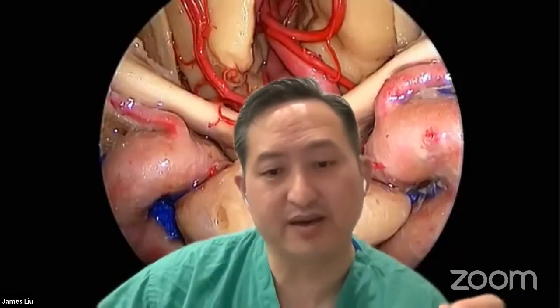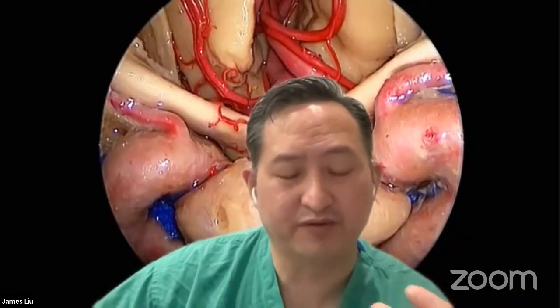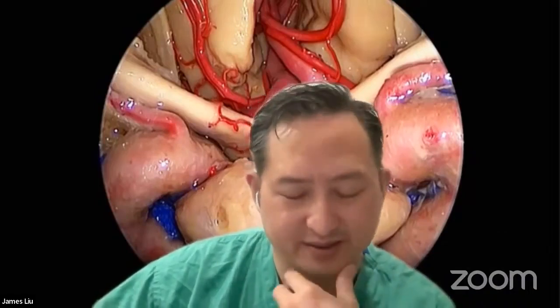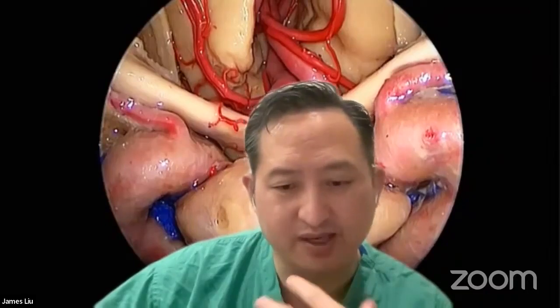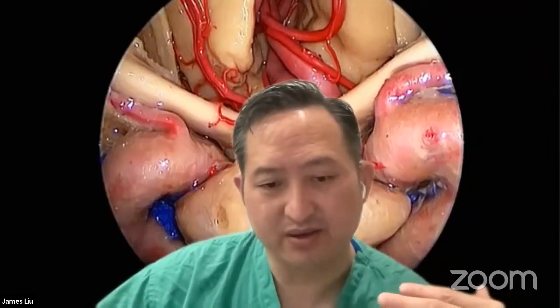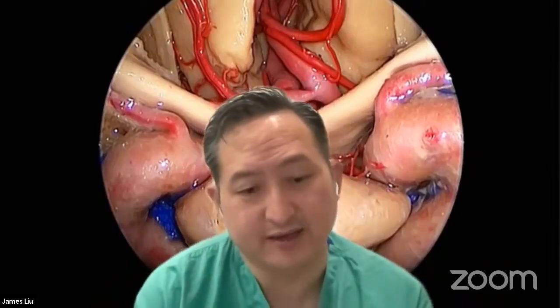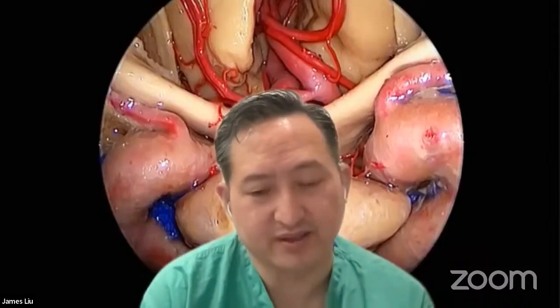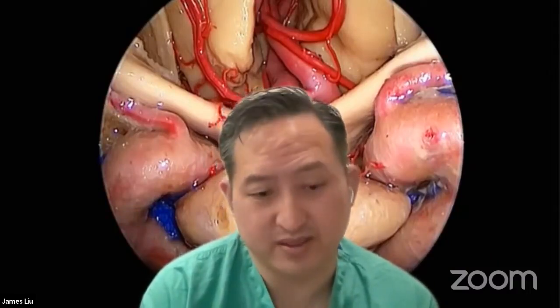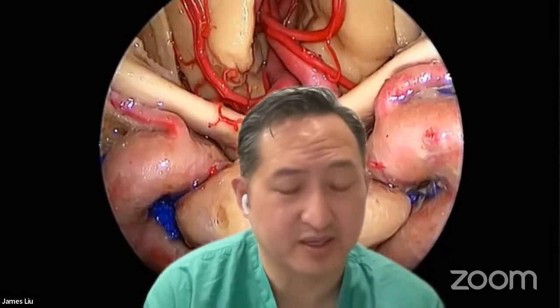So I prefer to do a combined approach in a single stage. And whether you do that from below first or craniotomy from above is variable. It really depends on the tumor appearance and location. So if the sella is nicely expanded and it looks like you can do a large portion of it endonasally, I will sometimes do endonasal first and then be prepared to do a craniotomy second. There are some cases where I've done it vice versa, the other way around. But the important thing is to remember that if you don't get it all, you could risk having post-op apoplexy. So I think I would prefer to do it at the same stage.